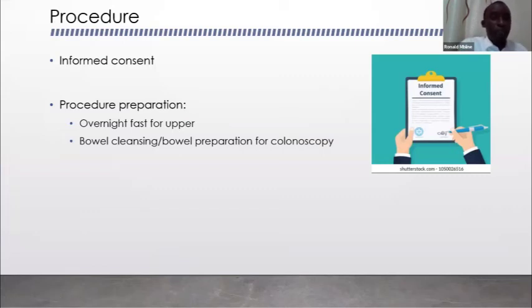Now, endoscopy is minimally invasive or minimally intrusive. We minimally enter without necessarily cutting open the person that is having this procedure. Often, you're going to have to sign a consent form. And with consent, this is called informed consent. So basically, it means one, you've been told what's going to be done. You've actually understood what's going to be done. You accept it. And the person who's going to conduct the procedure will explain each and every step as they take you through the procedure.